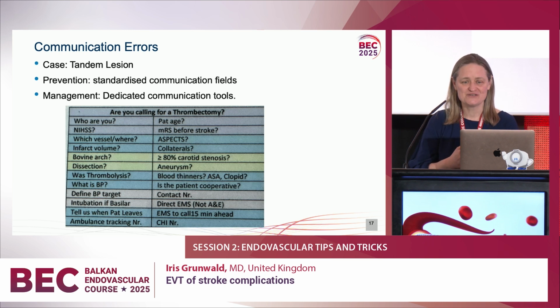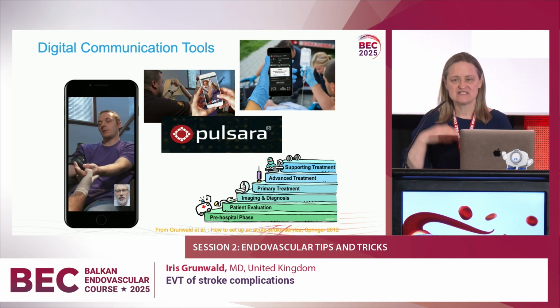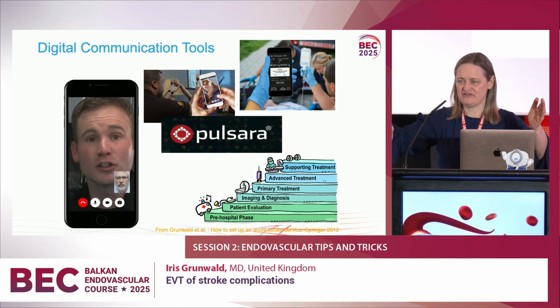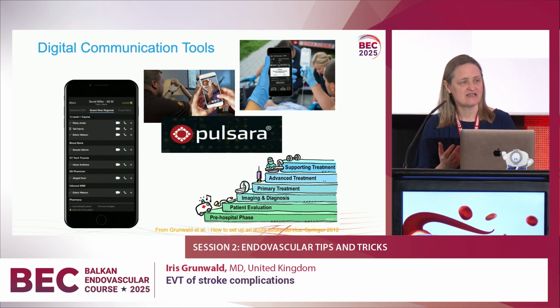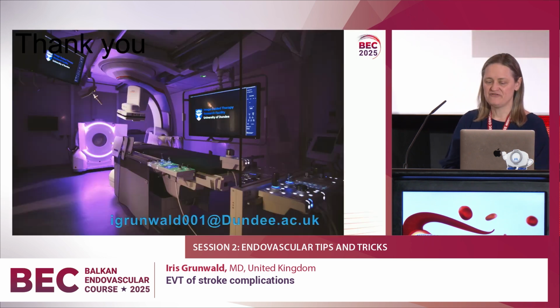Now, unfortunately, the next day I heard about it, and they said, oh, but Iris, we sent you an email correcting that. I don't have time to see emails when I'm in the cath lab. So this is where we have a dedicated communication tool, which gives us the possibility of standardizing the information that needs to be in there, and if there were any changes that come up in between, we would even see them come up on the screen in our angio room. It was also quite practical during COVID. We had another case where there was an additional subclavian stenosis, so the blood pressure measurements we were getting from one arm were not correct. So a communication tool is very helpful to avoid communication errors.